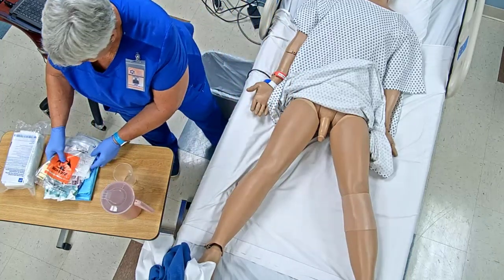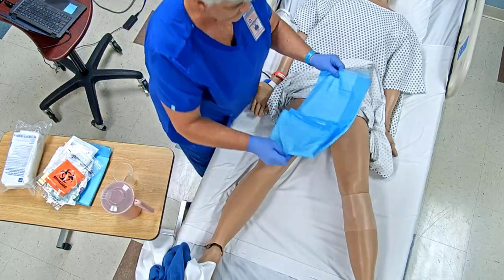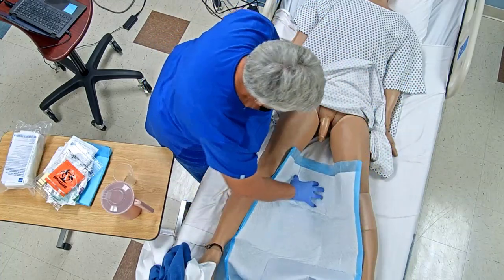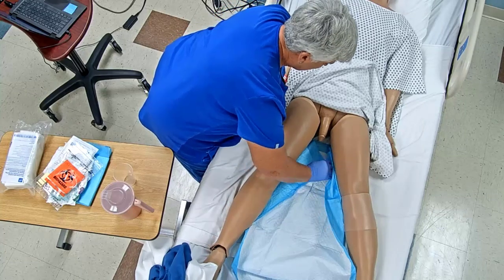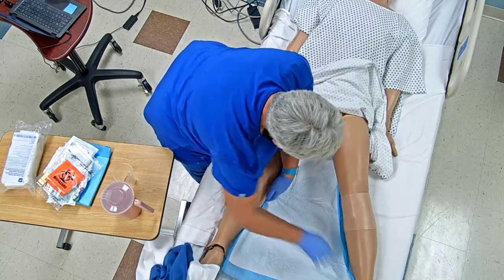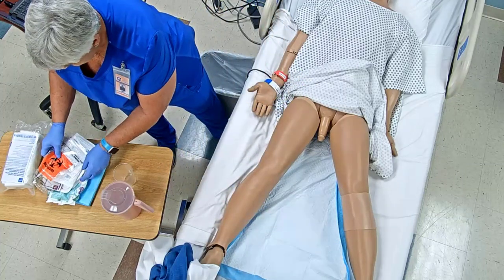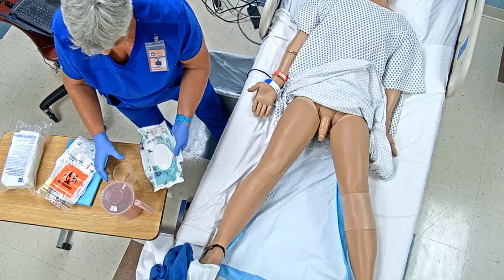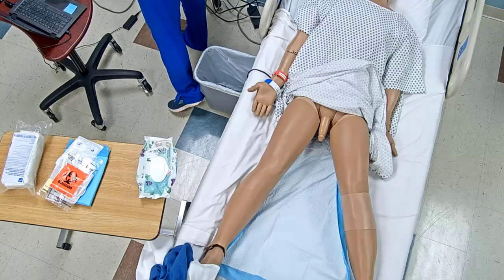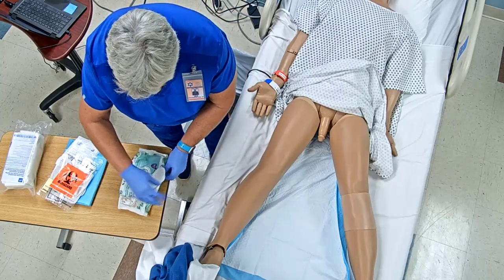We talked about the perineal care for a female with a Foley catheter, and also did a little bit about male pericare. I need you to bend this knee, and if you'll lift your hips up, we're just going to get that blue pad up underneath you. Now I'm going to go ahead and do a little pericare on you. These are warmed up. I'm going to move these off to the side. We'll be needing those, and I'll get you some fresh ones.